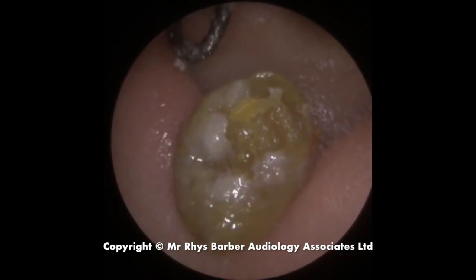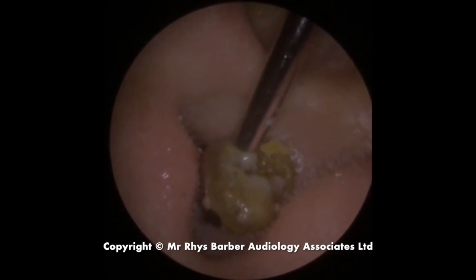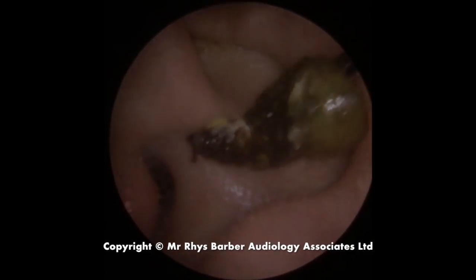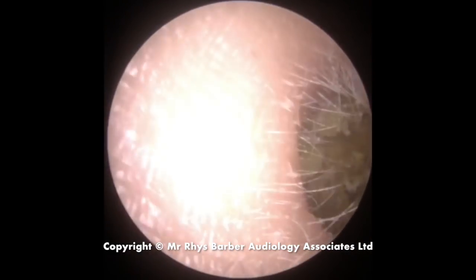It stayed in one piece. I'm just going to pick that up with the suction there to get it out of the canal. You can see two different colors — newer and older wax — and there's the eardrum looking nice and healthy.